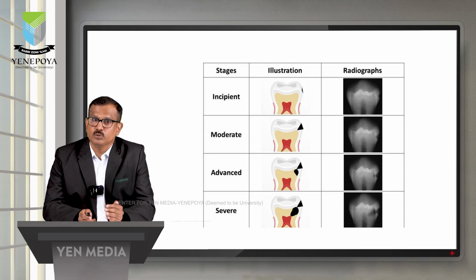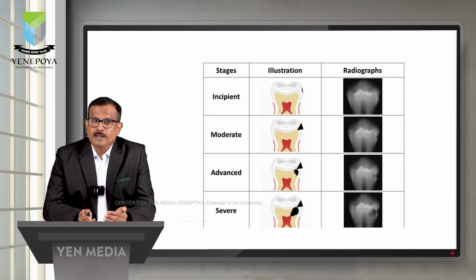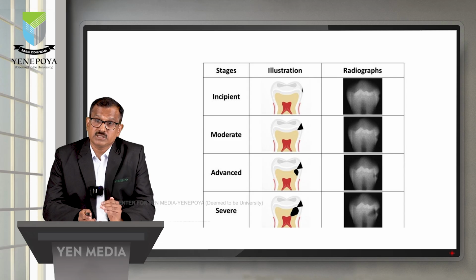That is when we really go into proper composite restorations, so-called posterior restorations. Then the cavity preparation becomes deeper, and there is another case wherein it might go to severe, that is deeper cases, wherein we will have to understand how to place liners, because modern liners are very good. We have gone much ahead in liners also.